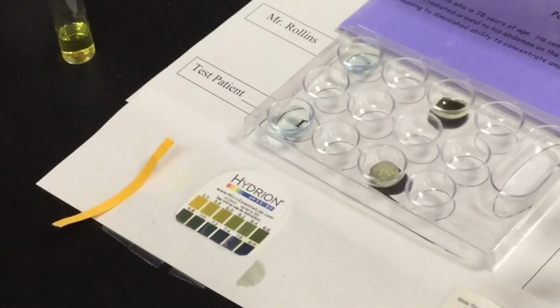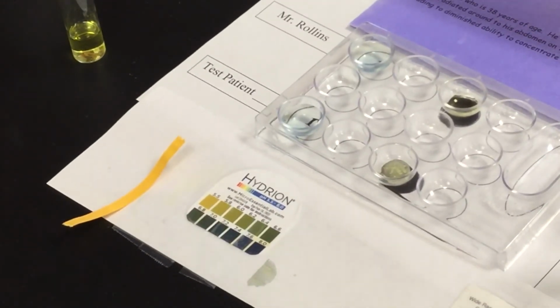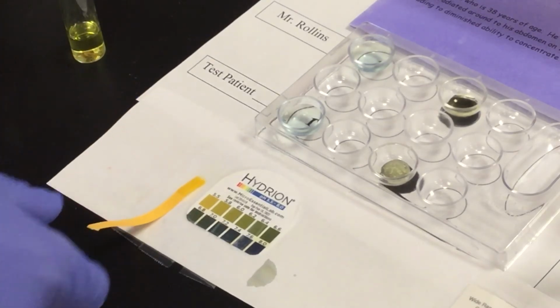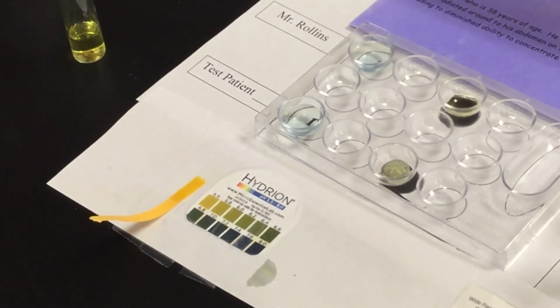We also have our second type of pH paper here. This one's going to be a little more exact, so you got a whole number there. This one's going to run 5.5 to 8. Same thing. I'll put a little bit of urine on the end of it, and you will be matching up the color that you see there, the best that you can. It's going to give you a little bit more specific number.